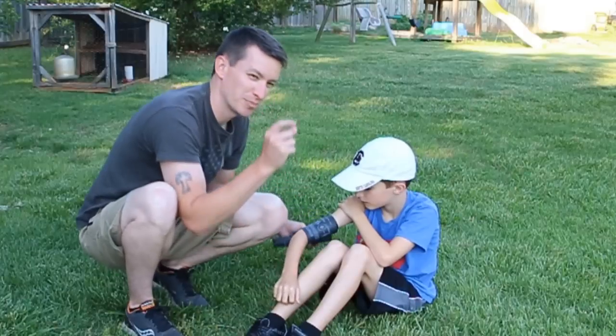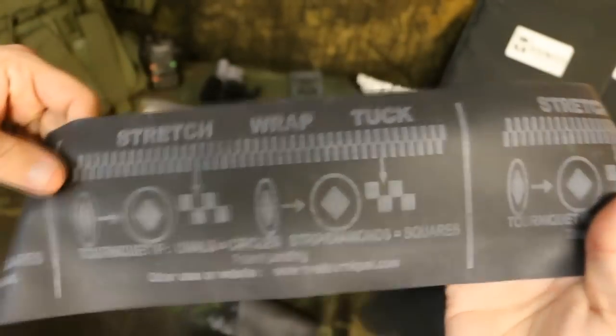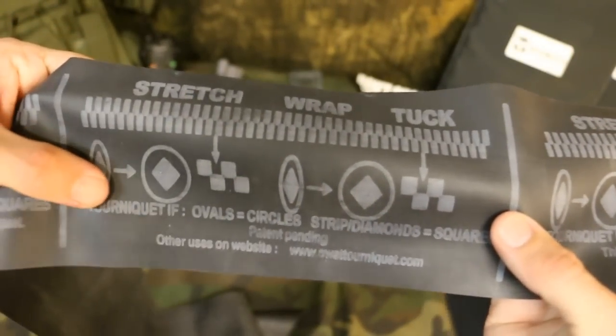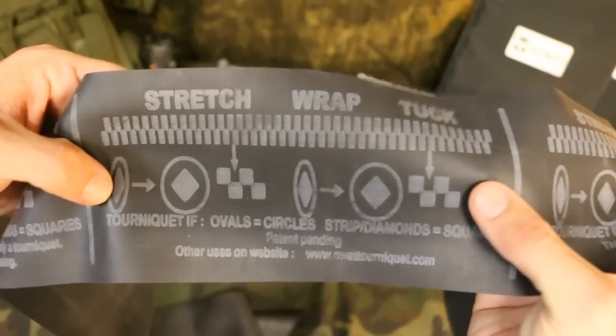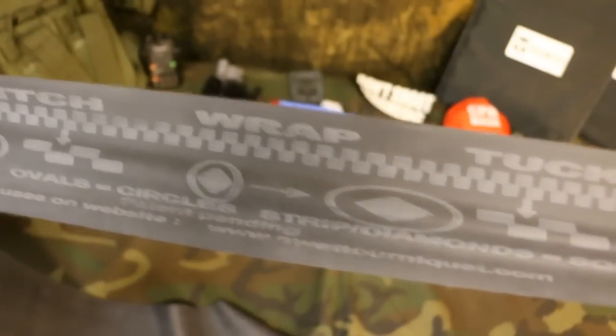Here's a closer look at the indicator markings. You can see that the tourniquet is tight enough when the ovals turn into circles — if this oval here turns into a circle — and then the diamonds turn into squares.